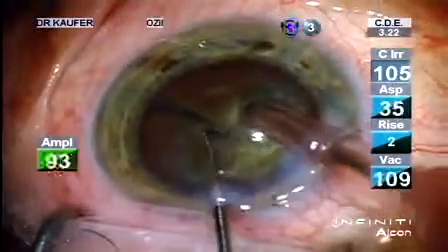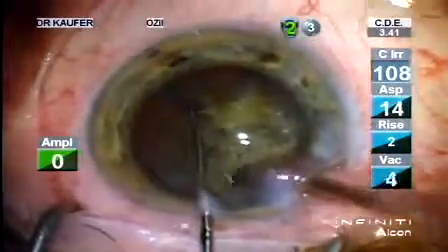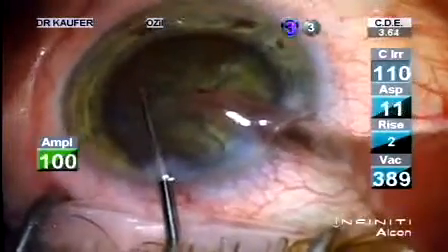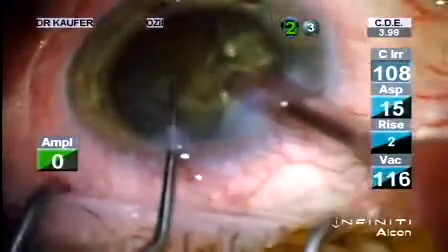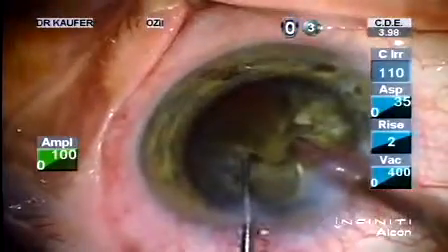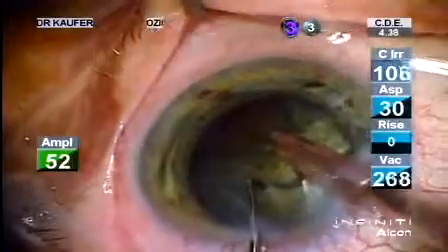Now that we have 4 quadrants, I will go ahead and divide each of these quadrants into 2 each. Now that we have enough pieces, what we'll do is we'll go to position 2, and each of these pieces is going to come easier because we have so many of them.